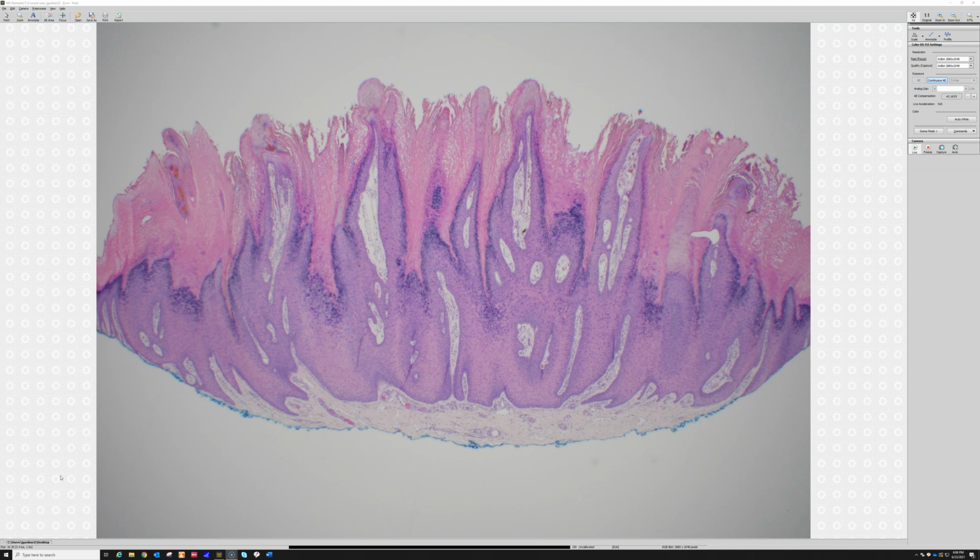Some of the HPV types can cause dysplasia and cancer in the anogenital area or the oral cavity. But the warts that we see on regular skin outside of the anogenital area, like this one here, which is on the arm or somewhere of a patient, are caused by a whole bunch of different HPV types. So the HPV causes the epidermis, the keratinocytes, to grow thick and make these finger-like projections, okay?